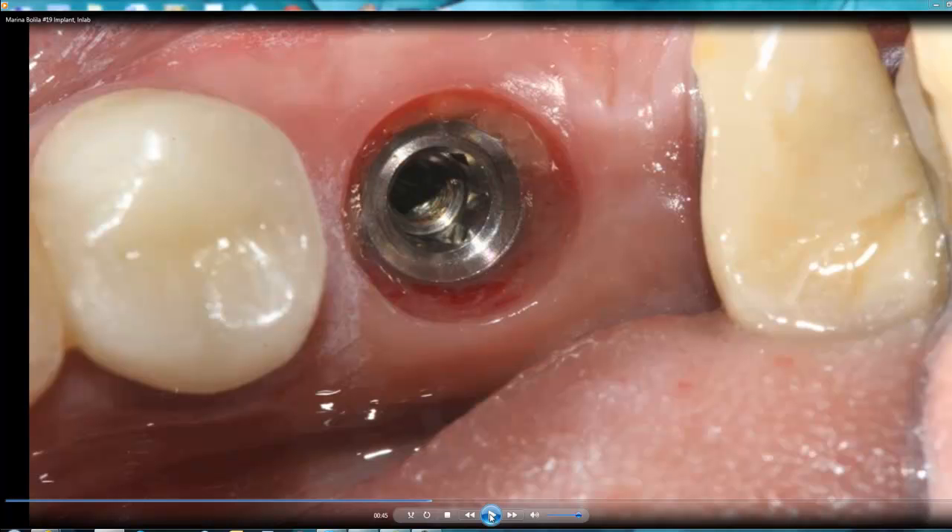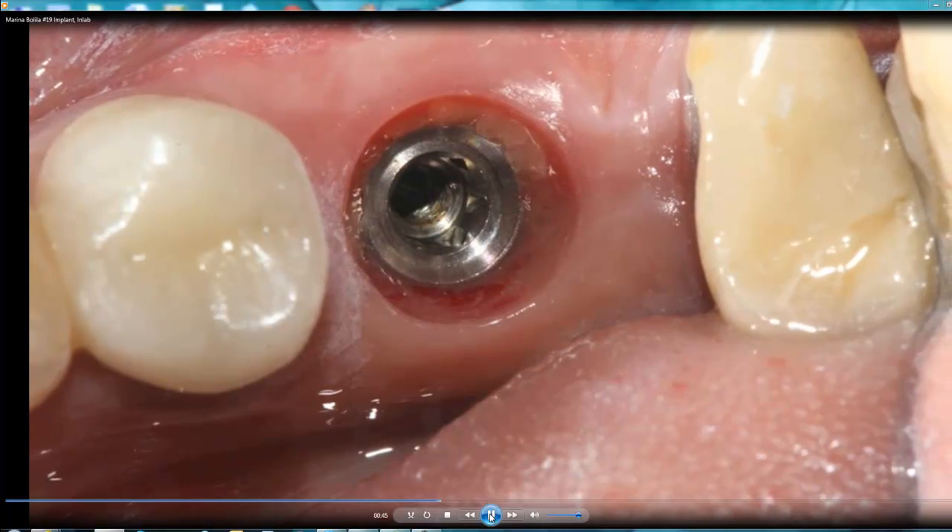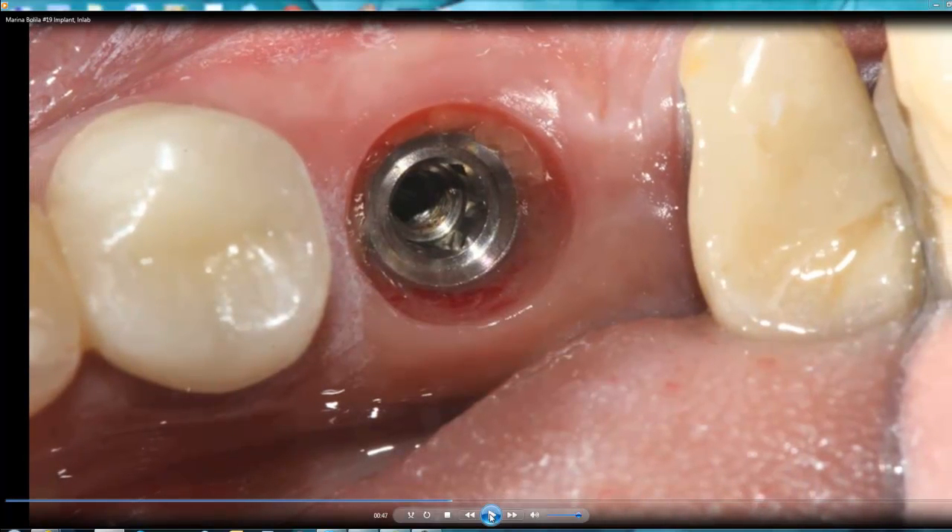We scanned the tissue while the patient was in the chair — no anesthesia involved, no extra time, just about 30 minutes. I scanned the implant site. I've been using MIS implants, but because there's no in-lab CEREC software for MIS specifically, I use Zimmer components since it's almost the same design. I use parts from Zimmer to restore MIS implants.